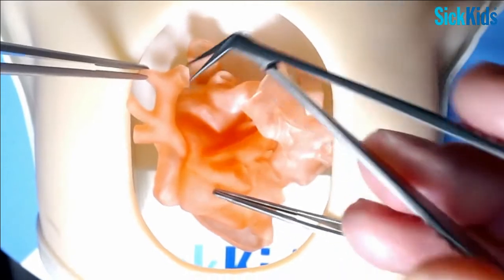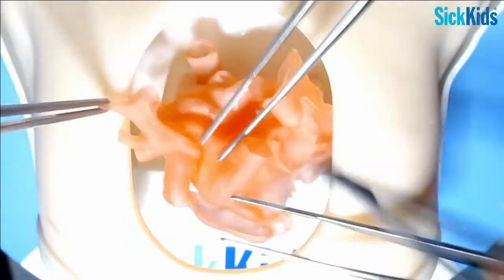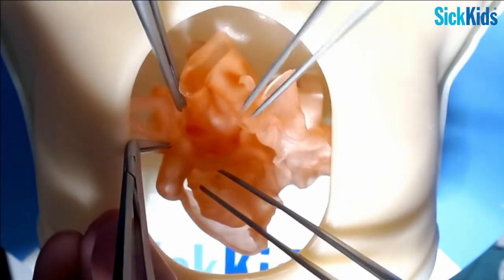Let me just slide in here. Can you hold that right there? Hold on, thanks.